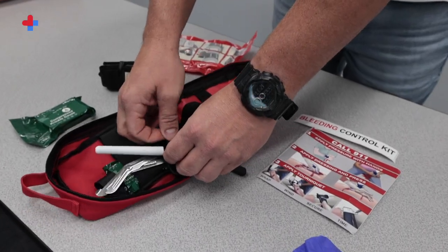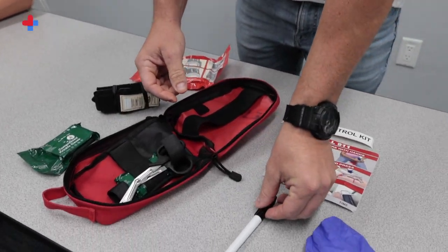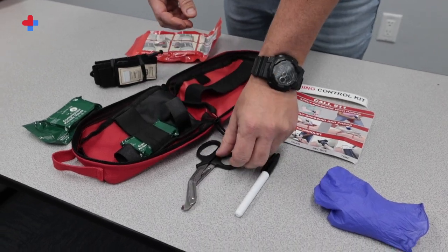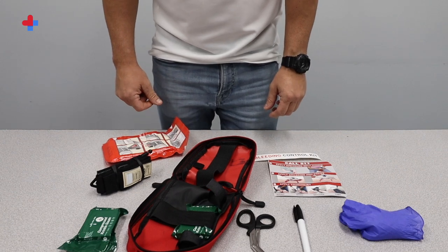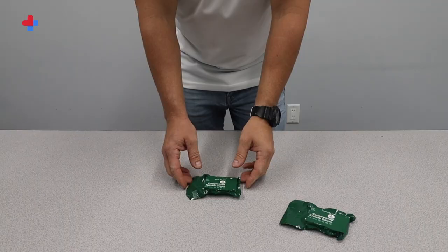A single pair of trauma shears are included for use as required. Lastly, the kit comes with a small permanent marker for documenting the time of tourniquet application. Each kit includes pictorial illustrations and a bleeding control kit label used to help others quickly identify the location where the kit can be found.